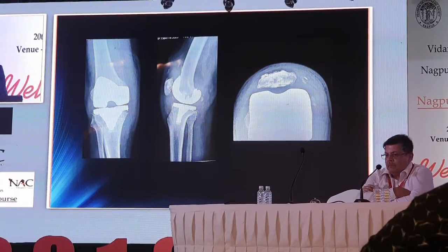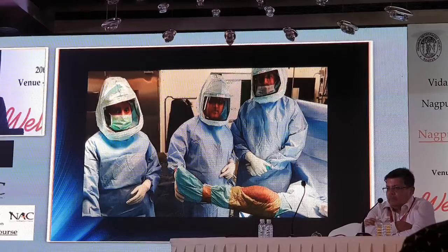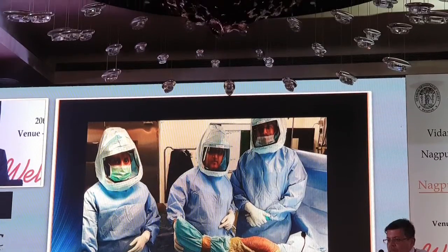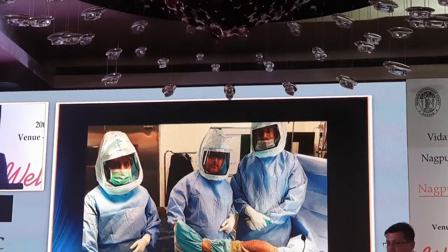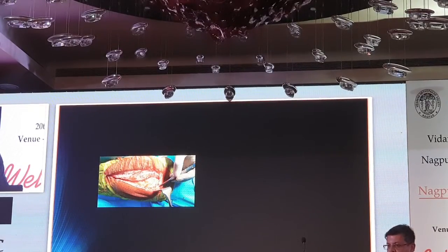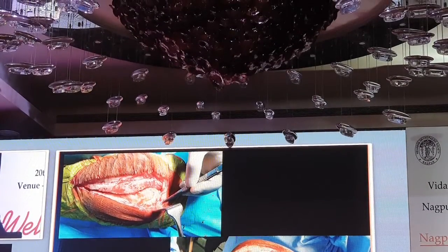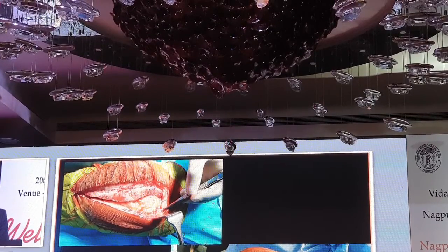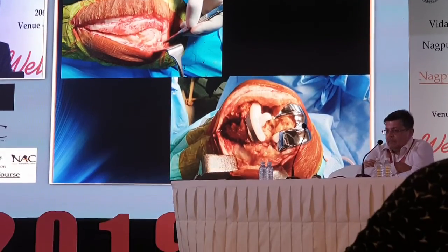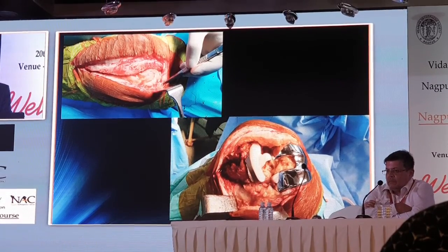This is an index case. Nicely draped and prepared even for implant removal like a proper knee replacement, with all aseptic precautions. Exposure has been done and you can see pus coming — so this is an infected first-stage revision. The first thing is a nice exposure. Usually in these cases we don't need to do quadriceps snip or tibial tubercle osteotomy. We must be very careful in not taking them as a routine approach.